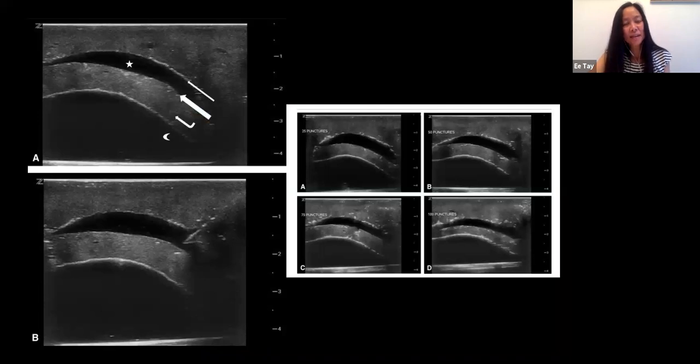So you see what we would call the pericardium, and then on the outside with the makeshift fluid. And then on B, you actually see the needle going in to try to aspirate. And the good thing about this particular phantom is that it's completely reusable. So the images on the right side show you what it looks like after multiple punctures. So the A is 25 punctures, which looks a little bit different than 100 punctures later, but it's really not that much different. So it actually looks pretty good, looks pretty sustainable for a short period of time for multiple puncture wounds.